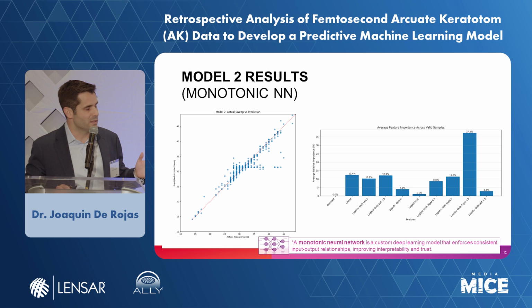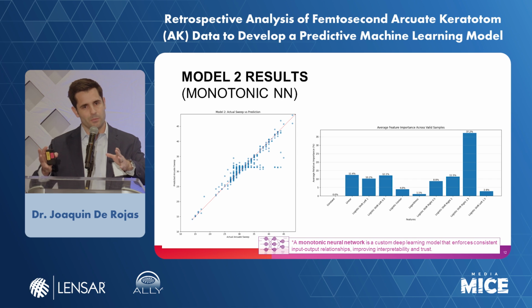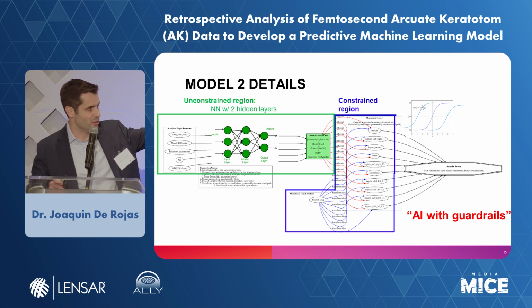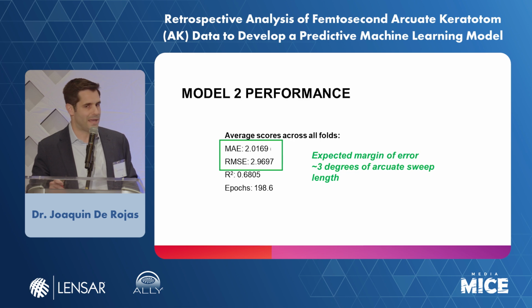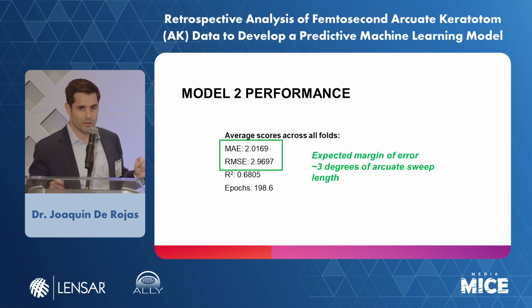The second model we ran was really thanks to Dustin, who's head of research at LENSAR. What we want to do is create the best of both worlds. Neural networks, like ChatGPT, hallucinate. It's a black box. You don't know what's going on. So combine that with something we can interpret, like linear regression. Combining the two together gives a monotonic neural network. Essentially, the green part is the neural network without constraints, which is very powerful. The blue one is the linear regression with constraints. The green feeds into the blue. It's AI with guardrails, and in healthcare, this is a big thing. We want to use AI, but with guardrails. So this model is not quite as good as the other one, but that's because we have more control over it and can interpret it better.